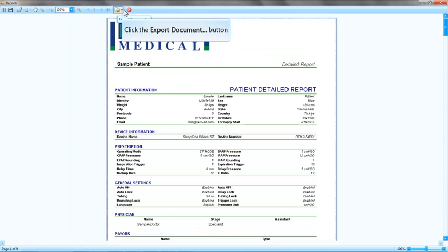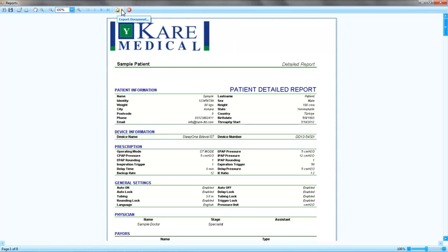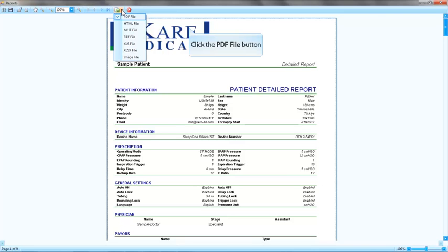For any report, you can export the reports to several different file formats. Now click on the Export Documents button. I want to save this report as PDF file. You can also save the file as web page files, rich text format, Excel spreadsheets or image file.